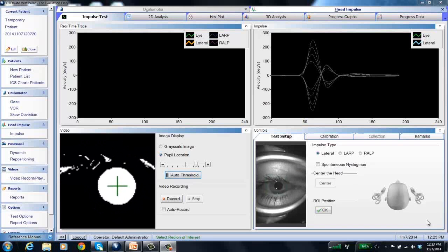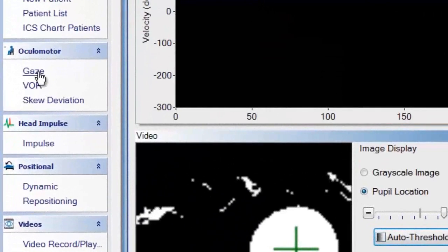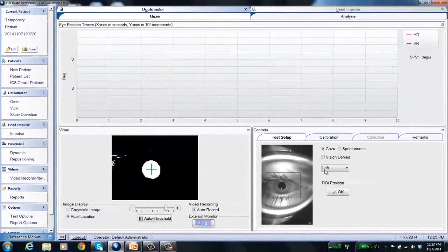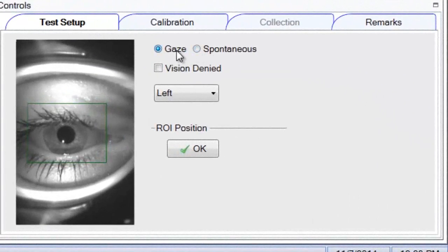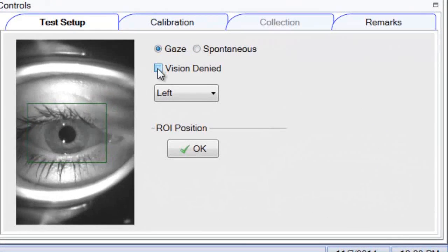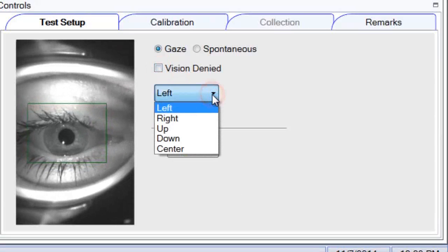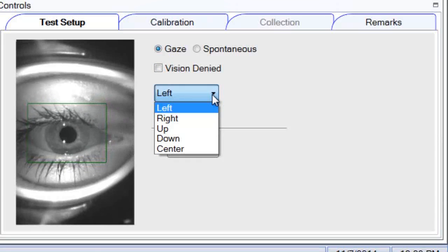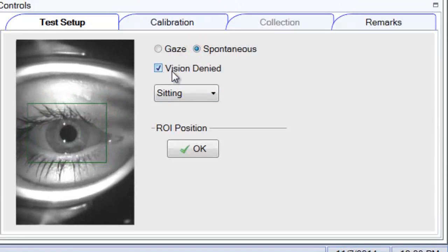To perform the gaze test, come to the navigation panel on the left and click gaze. You'll see two options: gaze and spontaneous. Under gaze, choose whether you're doing vision or vision denied — check that box if vision denied, leave it unchecked if not. Then choose which direction you're asking the patient to look: left, right, up, down, or center. For spontaneous, it's typically done with vision denied, so that box is automatically checked.